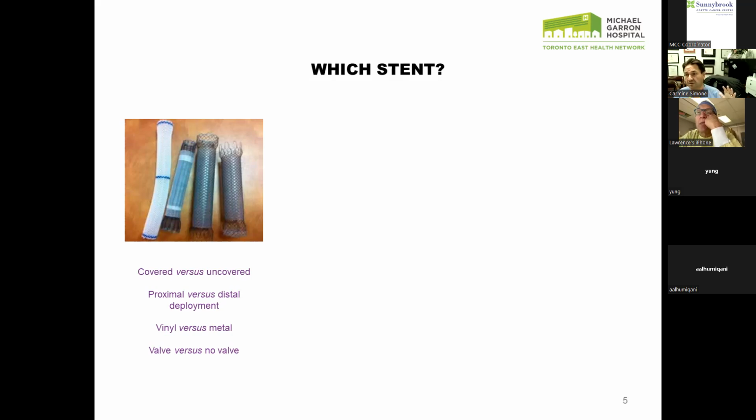We don't use the vinyl. Even though they are still available on the market, we no longer carry them and we no longer use them. They have a very, very high rate of displacement, and they very often basically get peristalsed into the stomach and out. Basically, we just always used to call those $1,000 bowel movements. So we normally don't put in the vinyl ones. So we just put in the metal.